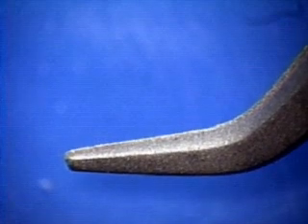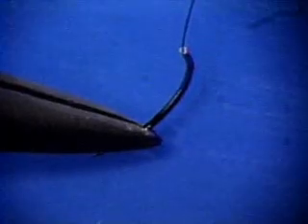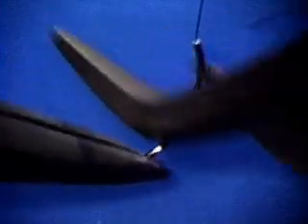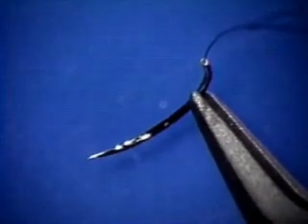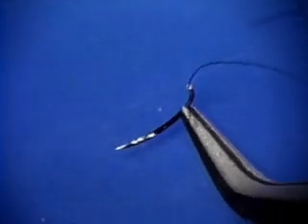The first point, use this part of the needle holder. If you hold the needle too far back here, you'll destroy the curve of the needle. If you hold it too close to the tip, with just a little extra squeeze, it'll flip out of there, just like this, and never be seen again.